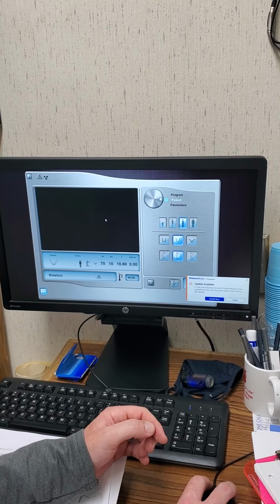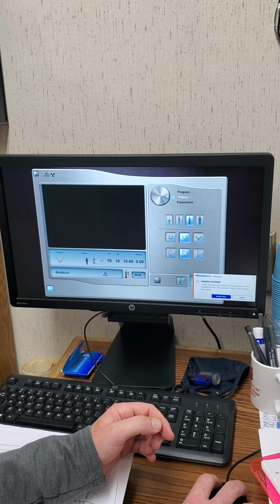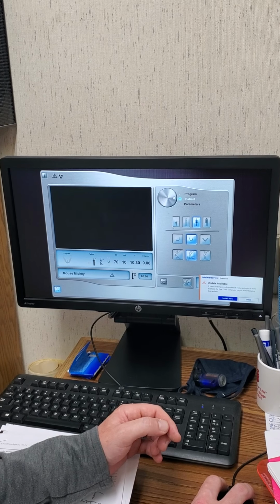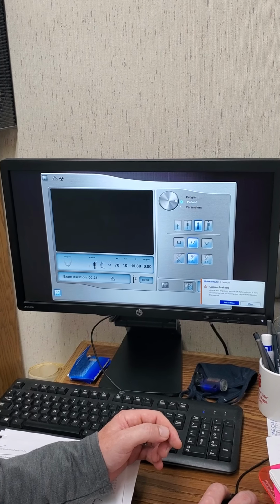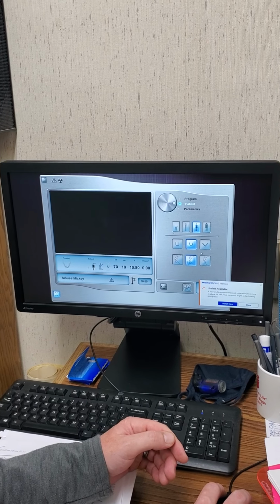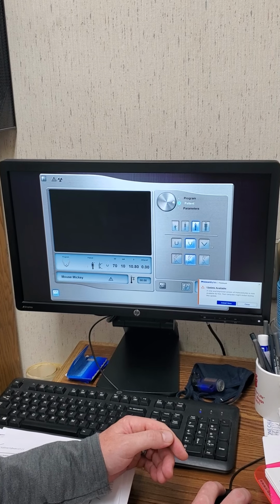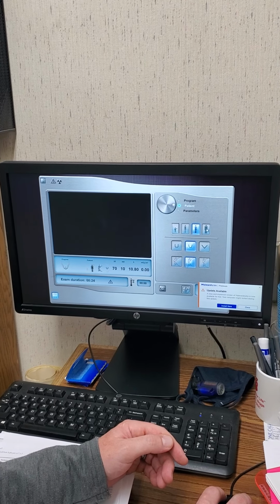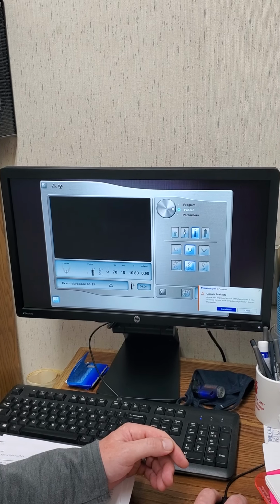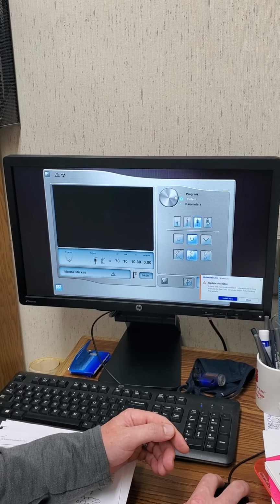The machine's going to get in its initial position. You have the option to select how they bite, if they're in a standard bite, if they have a lot of overbite, or if they have a protrusive bite, the general shape of their jaw, and then the size of your patient. This is going to be your average adult, small adult, large child, small child. This is going to be your larger adult.